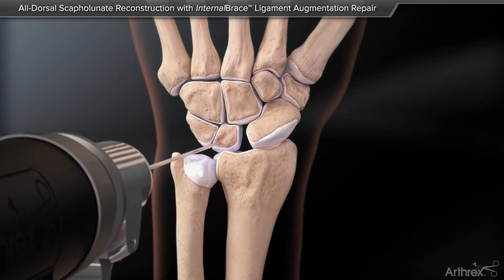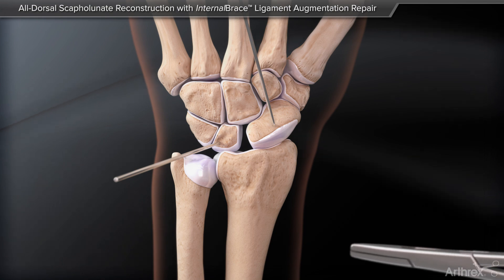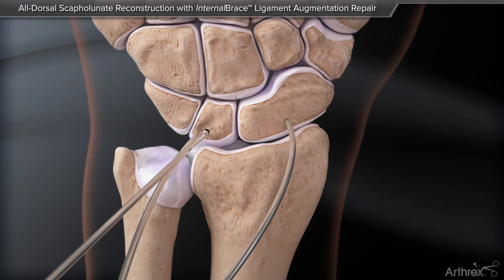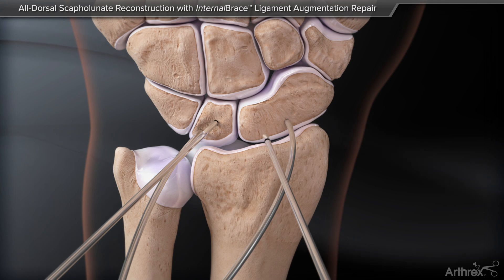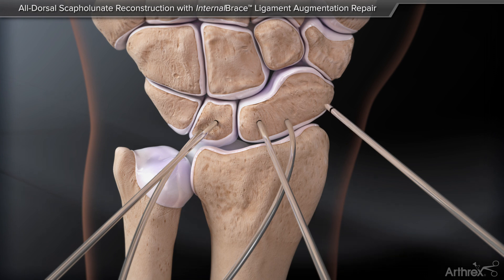To aid in reducing the scapholunate joint, place two guide wires to act as joysticks. Restore the joint to normal anatomic position. Place three guide wires: one centrally into the lunate, another into the proximal pole of the scaphoid, and a final guide wire into the distal pole of the scaphoid.